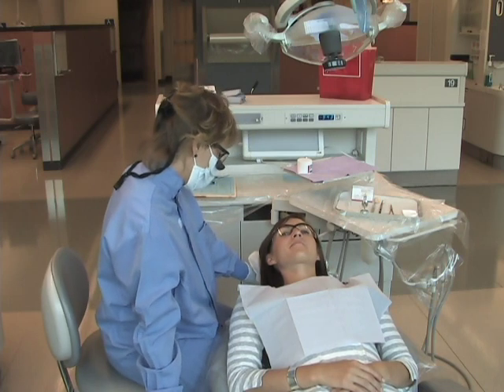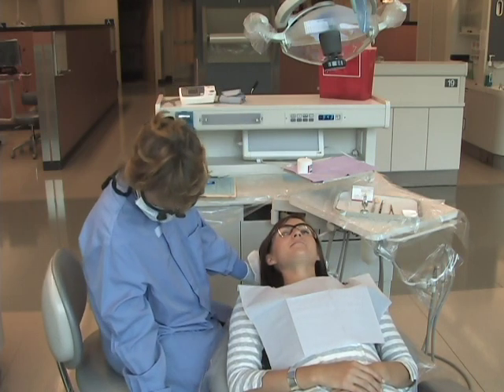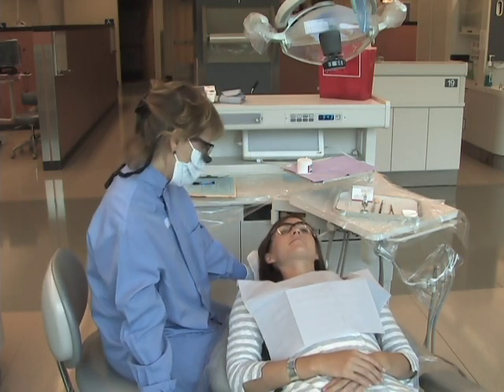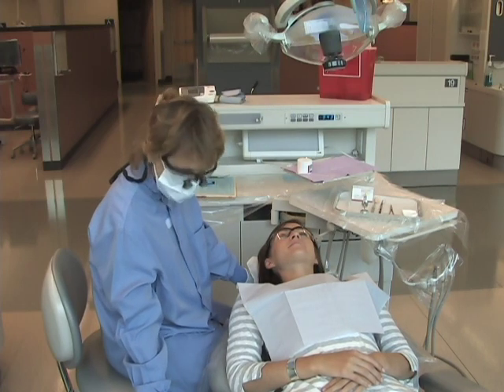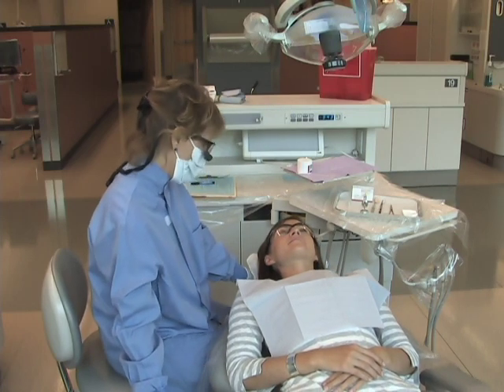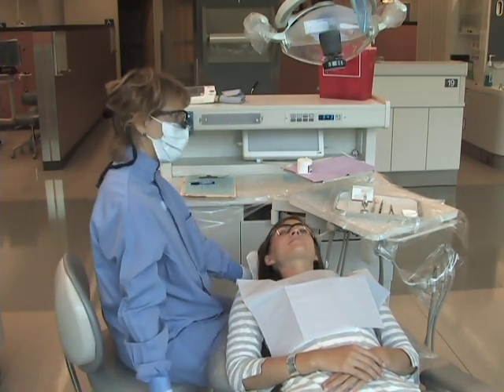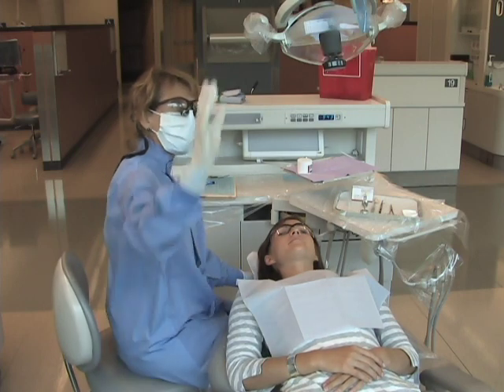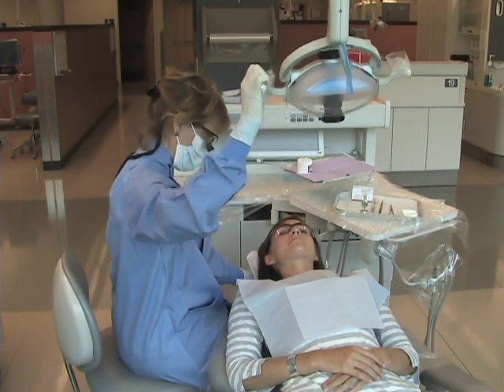If the operator is comfortable, the chances of administering a painless injection are increased. An uncomfortable operator is more likely to hurry through the procedure, making it more unpleasant for the patient and contributing to increased patient fear.